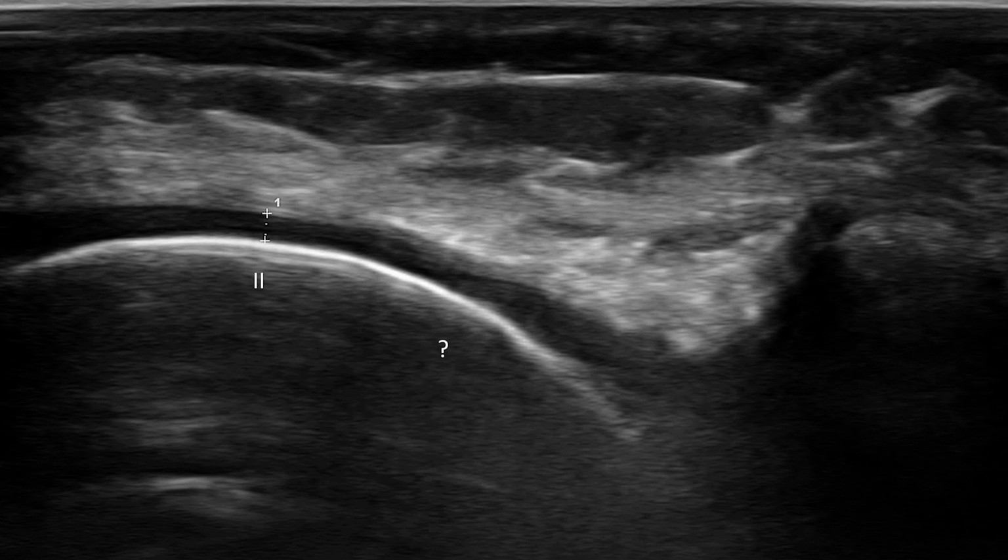If the ultrasound beam strikes the cartilage at an oblique angle, not all echoes return directly to the transducer. This may create an apparent irregularity or thinning that is not truly pathological. Accurate evaluation requires the cartilage surface to be as parallel as possible to the probe face.